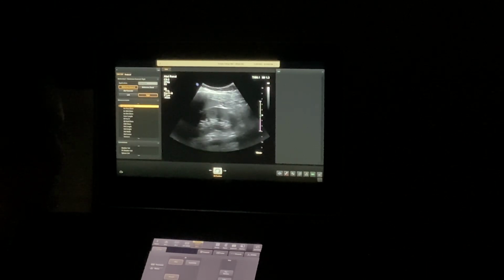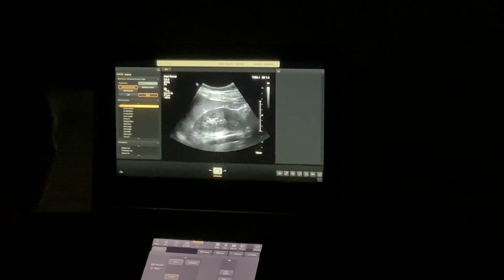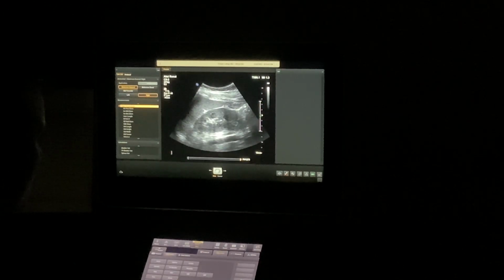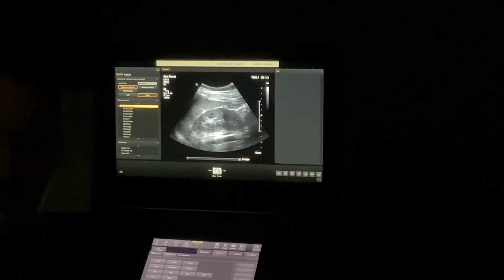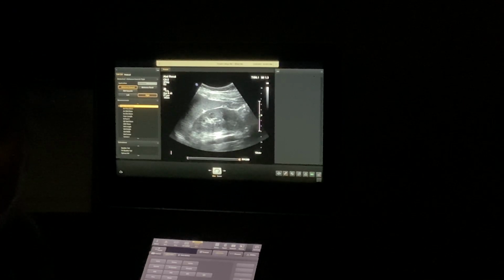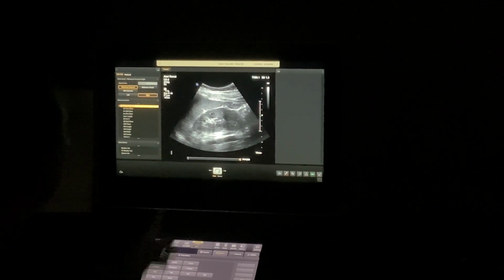So hold your breathing. Teacher, what is right underneath that kidney pulsating? Oh my gosh, it's beautiful. Breathe. What is that? Aorta. What? I'm just kidding. Listen to me. Say it again and say it like you mean it. I think it's the aorta. That's right. That is the aorta. Don't second guess yourself. You were correct. I just want you to say it louder. Okay. That's her actual aorta.